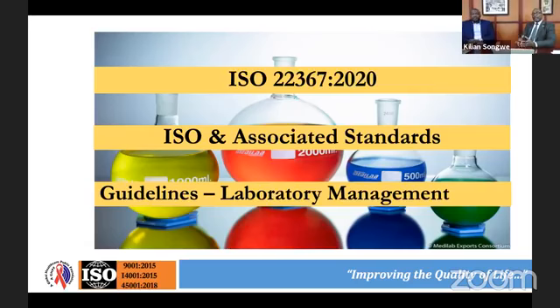We are actually allowing somebody from outside to compare us with another group of people, but also to compare us against our own platform in a different range. And then there is, of course, the element of internal quality controls, which is critical because it allows us to build the element of trend. It allows us to look into the element of bias, which is crucial in terms of how we see that there is a potential error coming down the line.